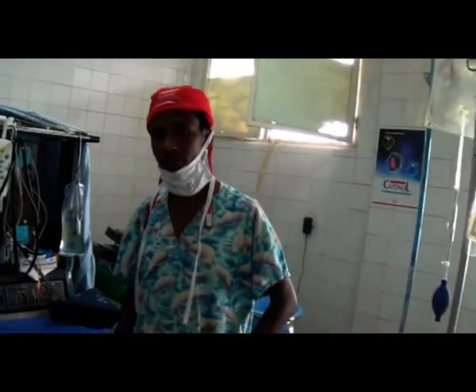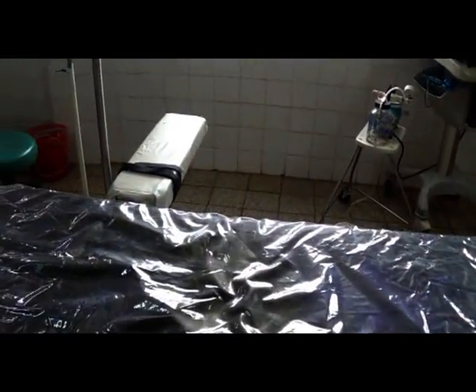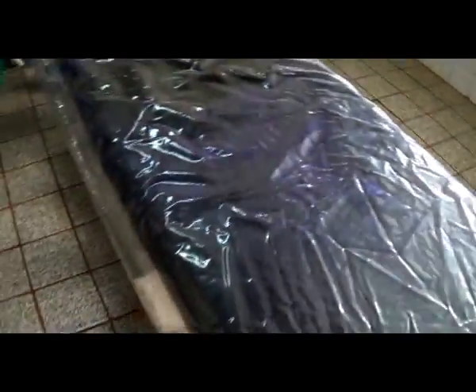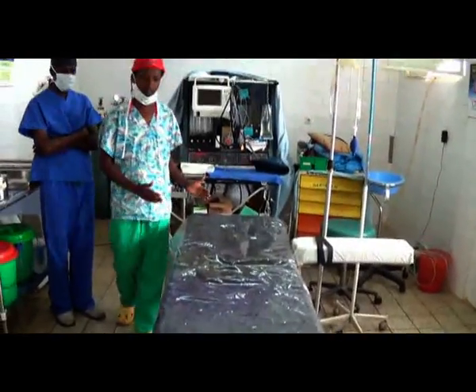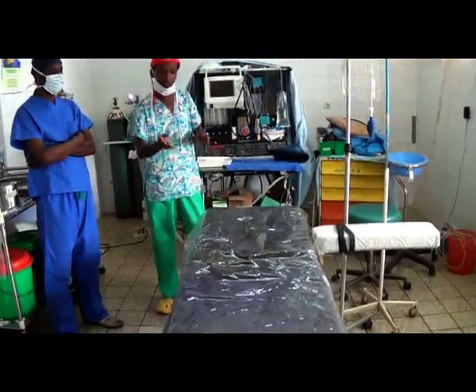Okay, thank you. Would you tell me a few points about this operation bed, which is very rusty down here? Okay. Yeah, actually, it is difficult to say this one is a standardized operation table, because a standardized table has its own unique properties, and this one does not. I don't think this is the standard OR table, because an OR table has its own parts, the flexible parts. This one has nothing. It's not flexible. You can rather call it a bed.